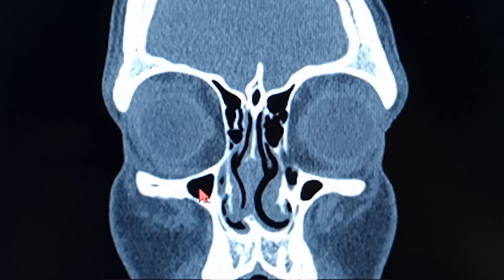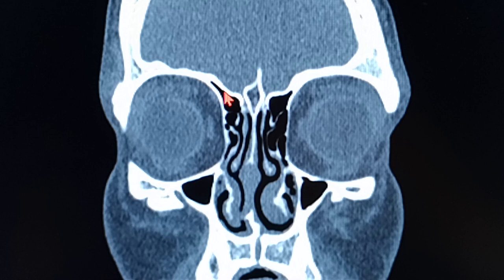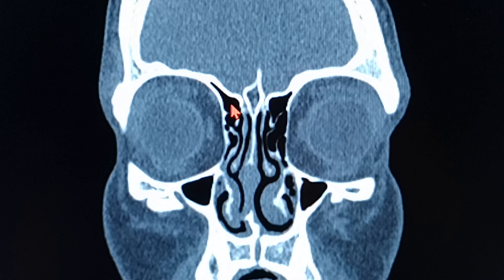if you see that the maxillary sinus is appearing more and more bigger, and still you can see something like a frontal recess behind, I'll repeat this, okay? If you see the maxillary sinus becoming more and more big in appearance, and if you still see something like the frontal recess, mind my word, frontal recess and not the sinus, that has to be definitely a supraorbital opening, that is a supraorbital cell or a supraorbital recess, definitely.